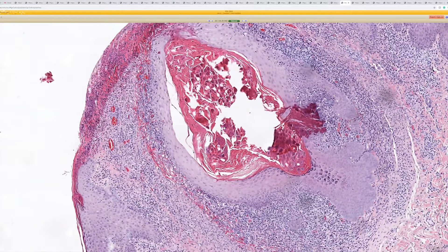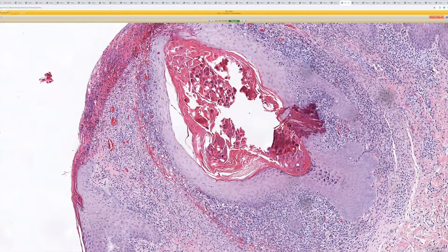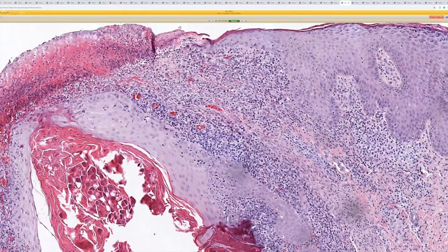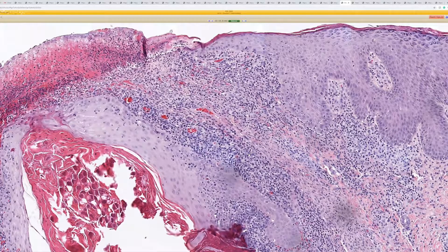Molluscum often ruptures and induces an intense dermal inflammatory response. I've seen it mimic lymphoma.